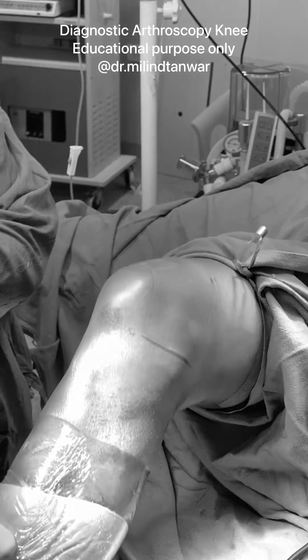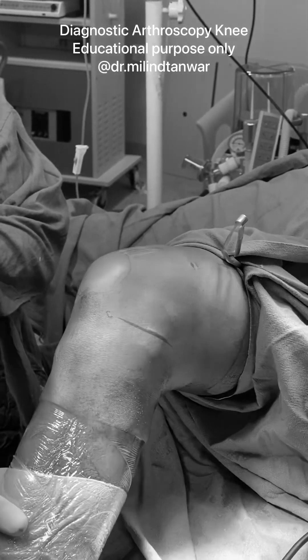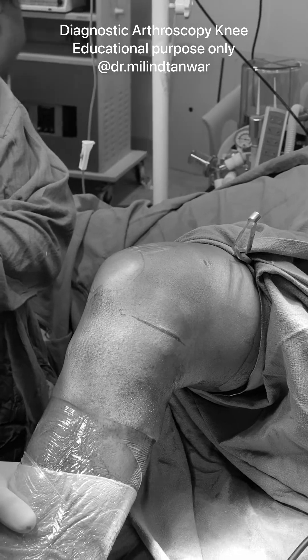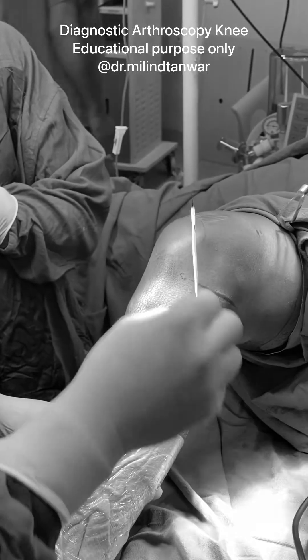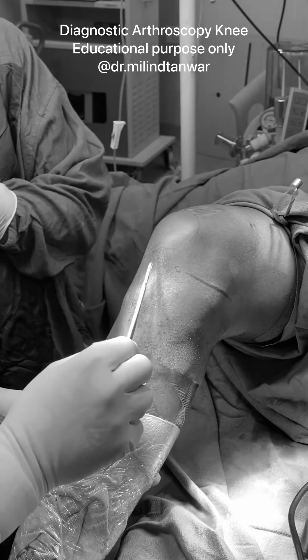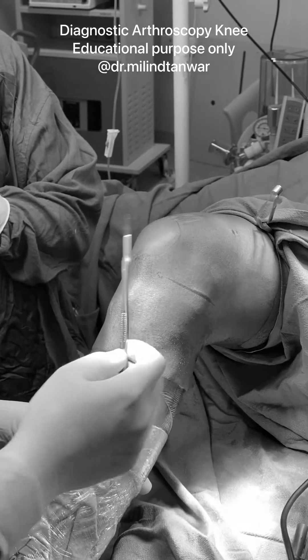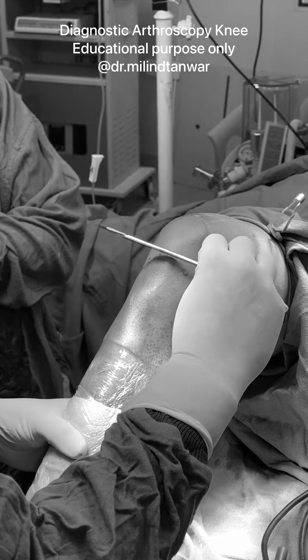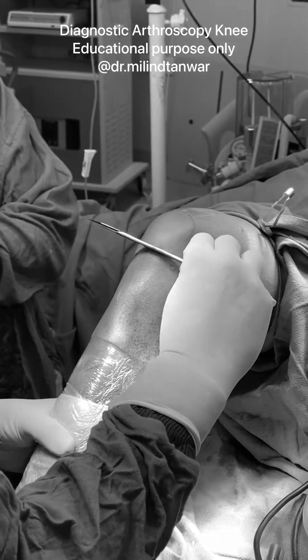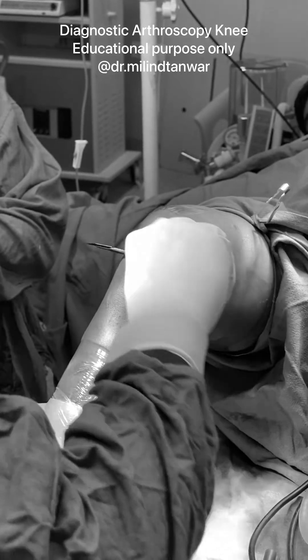This is a diagnostic arthroscopy showing how to go about a diagnostic arthroscopy. The first thing when you are alone is to hold the leg along with your own body weight support and mark everything — the patella, the patellar tendon, and the joint line. I have marked my tentative portals and the joint line. You can palpate the lower border of the patella and mark it.